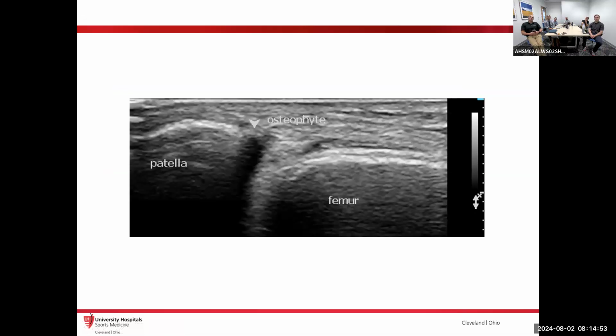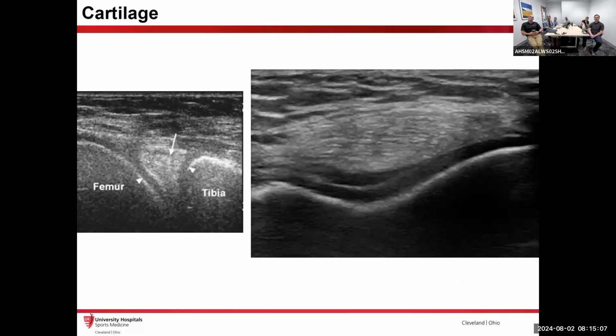Patella osteophyte creating a little bit of a shadow there, so it's a way to kind of know. So you don't want to say, oh, look, they've got fluid, we better tap that, right? You're not gonna tap that. That's just a shadow. Biopsy. Yeah, you're gonna end up with a bone biopsy, exactly.